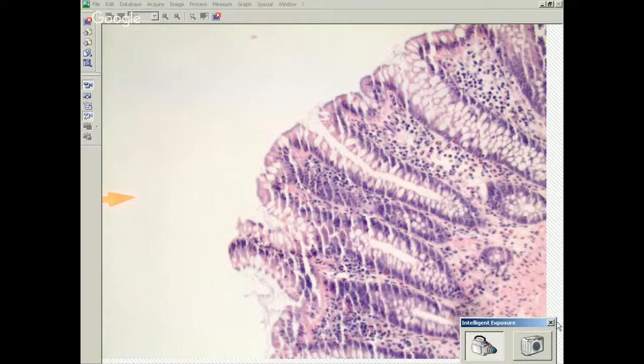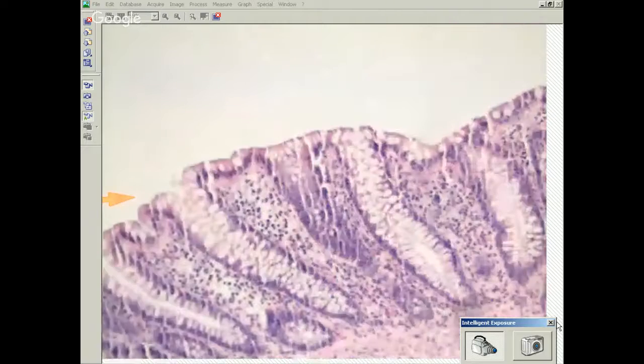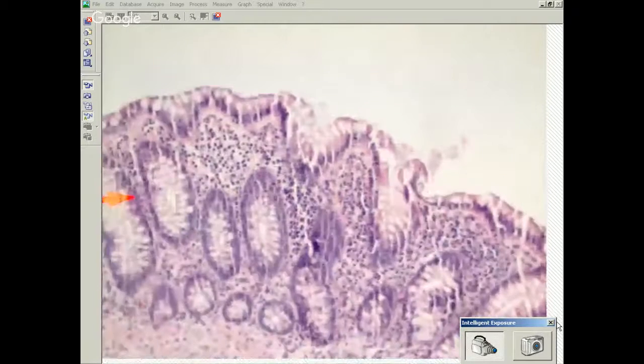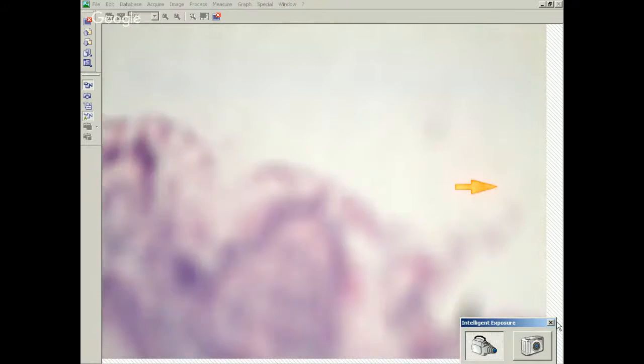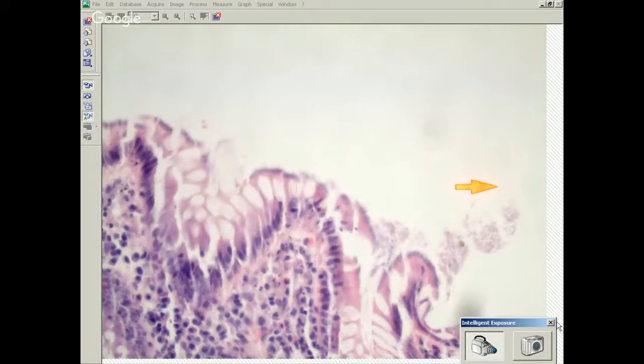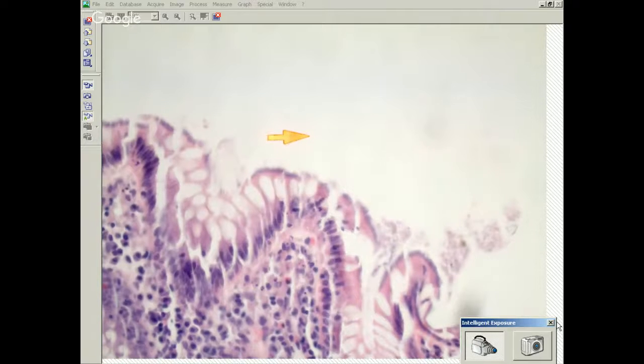Collagenous, okay. It's not the best picture or the best slide, but there might be somewhat of a prominent basement membrane, but it's not enough for collagenous. There is this fuzzy thing at the top, right? Yes, the fuzzy thing at the top. Let's go on higher power. So what could this be? Spirochetes. Yes, it's spirochetosis. These are Brachyspira species.